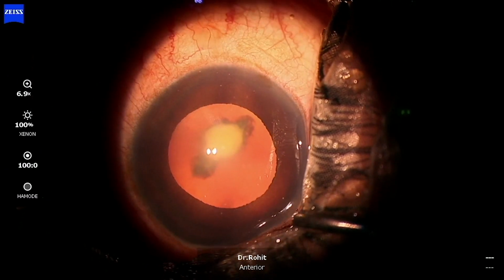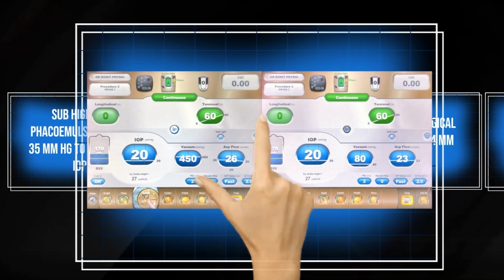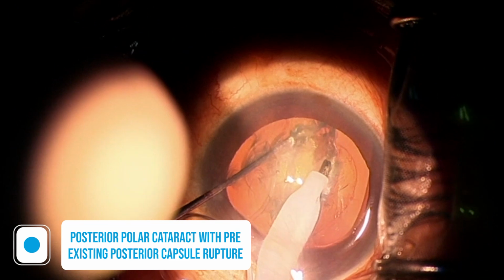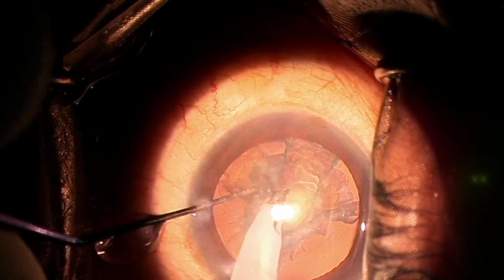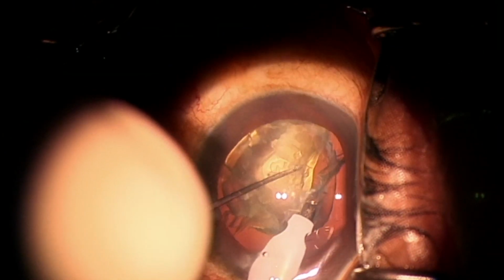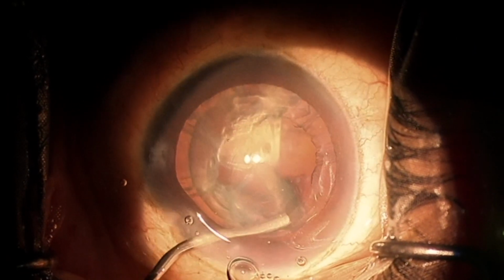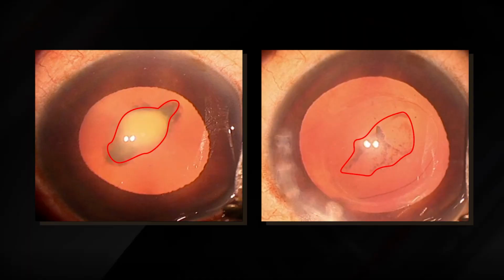For this patient of posterior polar cataract with pre-existing defect, I'll use physiological IOP settings. There is stable chamber setting. There is no undue deepening of anterior chamber, no undue posterior bulging, and extension of posterior capsule because of high pressure. The low infusion of fluid doesn't push more fluid into the vitreous, thereby not hydrating the vitreous. Minimal pressure difference between anterior segment and posterior segment is making the nuclear fragments float in anterior segment without being pushed posteriorly. You can see that the size of posterior capsular rent has remained the same.